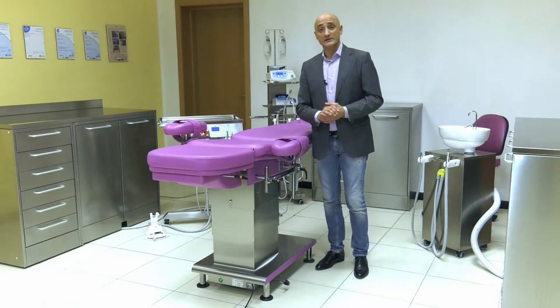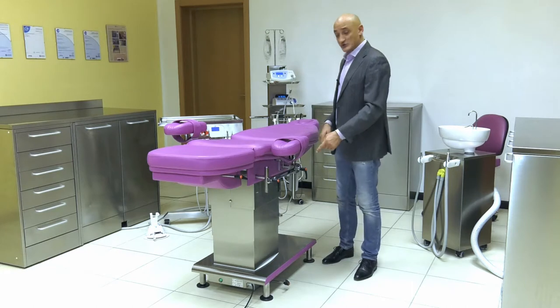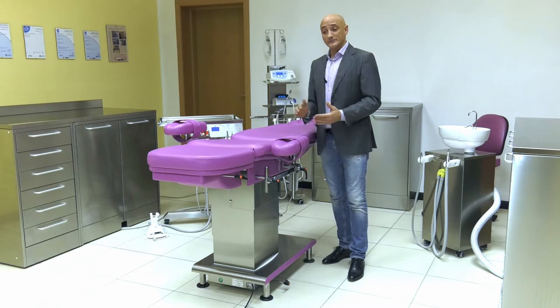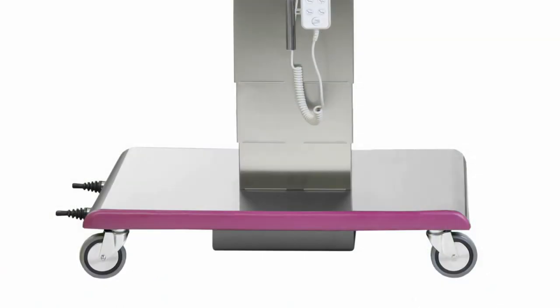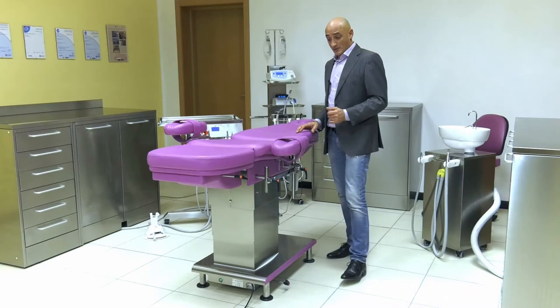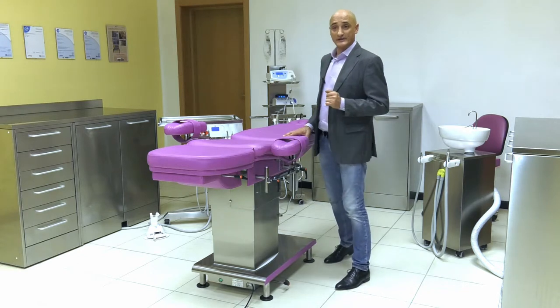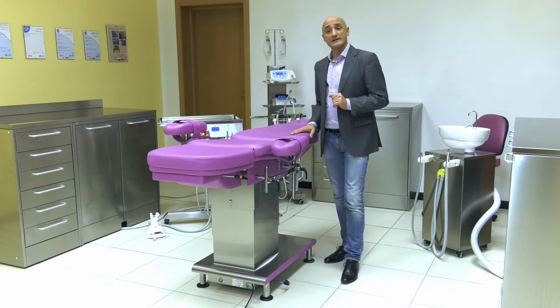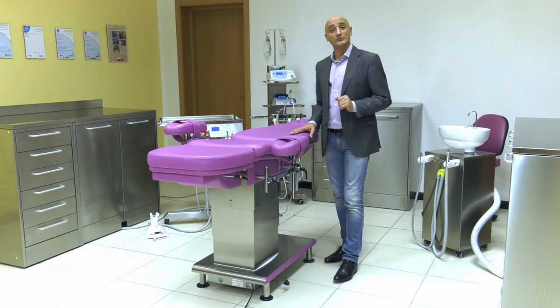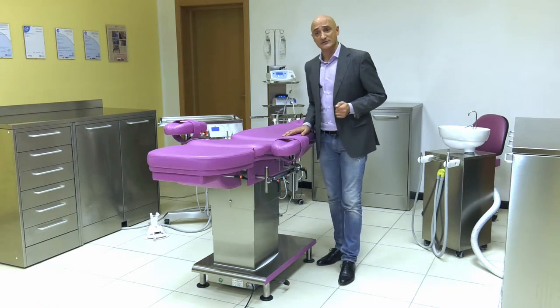Available options include having 4 wheels with brakes instead of the 4 feet, which would allow moving the chair easily into a post-operative area by simply unplugging the Schuko plug connecting it to the mains. Furthermore, if we add an uninterruptible power supply to the options, it will be possible to move the chair even when there is no power, for up to an hour.